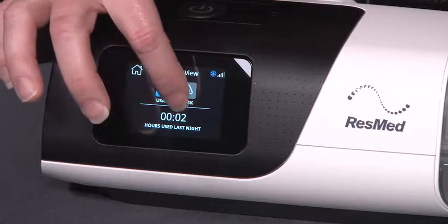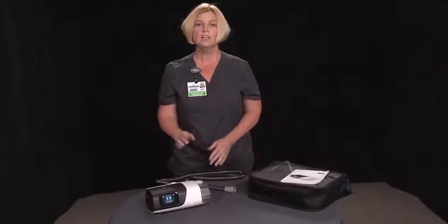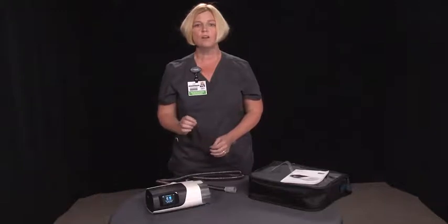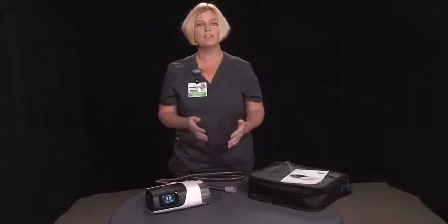To see how well your mask is fitting, you would press this button, and that would tell you that you had a good seal with your mask last night. If you get a yellow question mark, that means that your mask seal may not have been good enough. You may have had some times of large leak, so you'll want to readjust your mask as you're laying down in the bed at night.